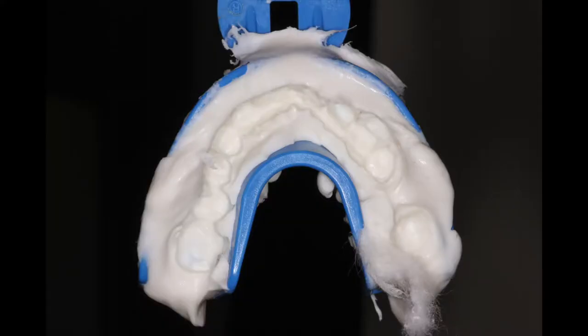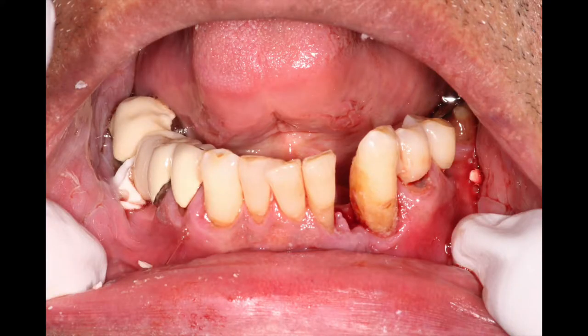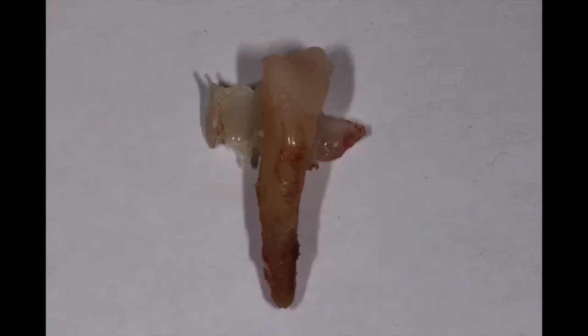We removed the preliminary impression — it's a full arch tray. This is the first time it's ever happened, but his actual tooth came out in the impression. Thankfully he was numb at the time, but you can see tooth number 23 is no longer there, and there it is all by itself. You can see the composite wings that broke off when it was taken out during the impression removal.